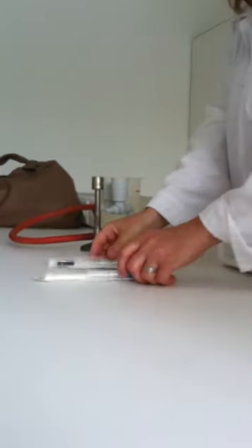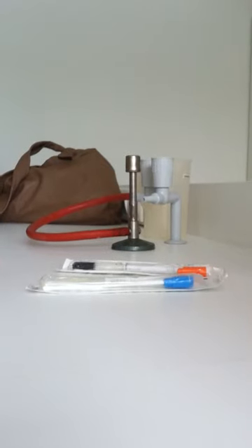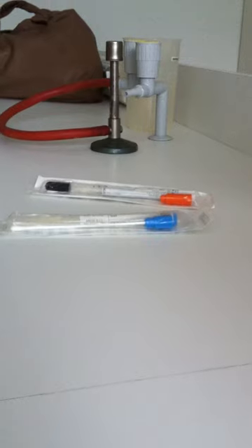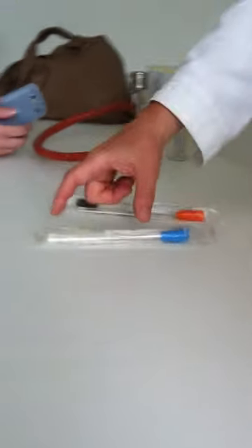And the last, which is very popular and very useful, the swab and the transport medium. For example, you can collect a wound sample. You can collect from ear, nose, throat, eye, vagina, abscess. So you should put the swab into the specific area, touch the throat wall or introduce it into the nose or ear. Or for the conjunctiva, this is a little bit smaller.